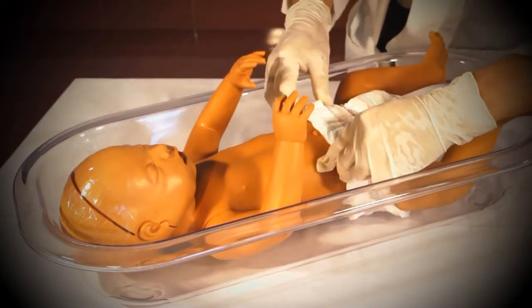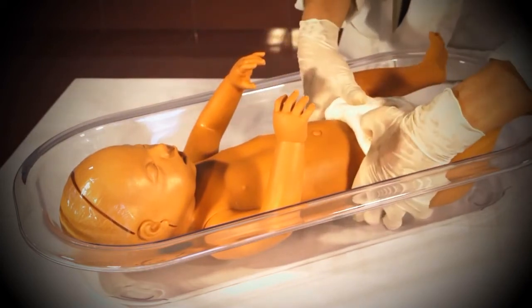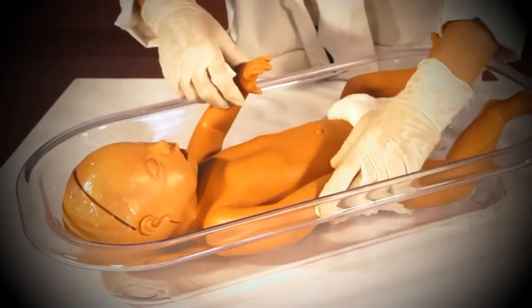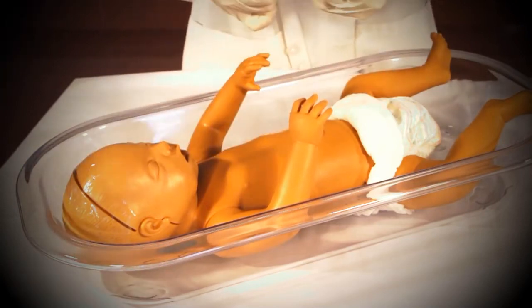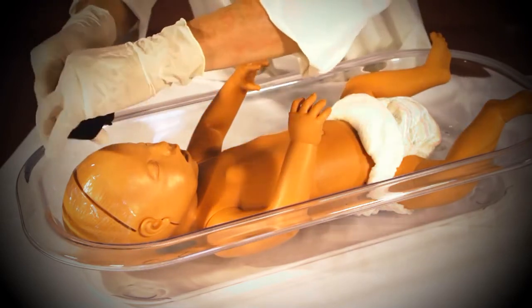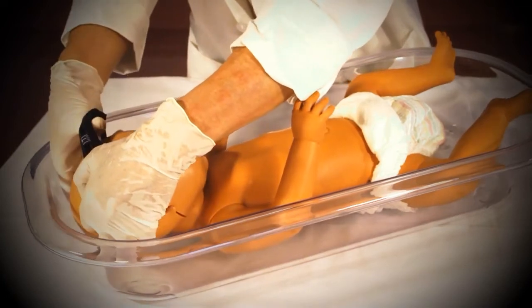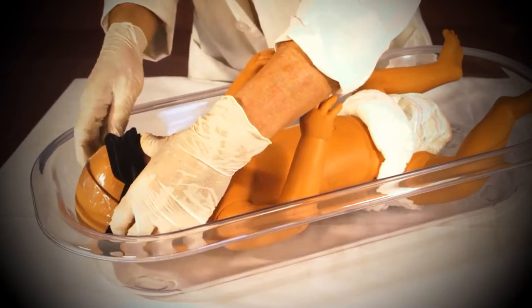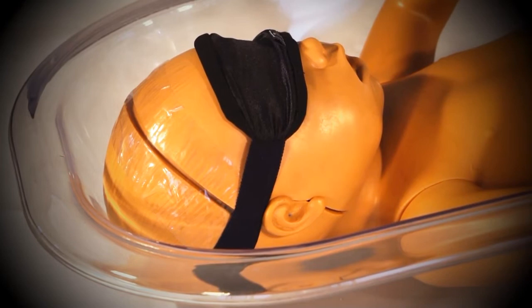To ensure effective treatment, make sure that the baby is not covered by blankets or clothes other than a diaper or diaper cloth. To ensure optimal light exposure, it is important to ensure that the diaper does not cover more skin than necessary. Now cover the baby's eyes with an eye patch or eye mask. All babies receiving phototherapy must have their eyes covered during the entire time they are exposed to the phototherapy light.